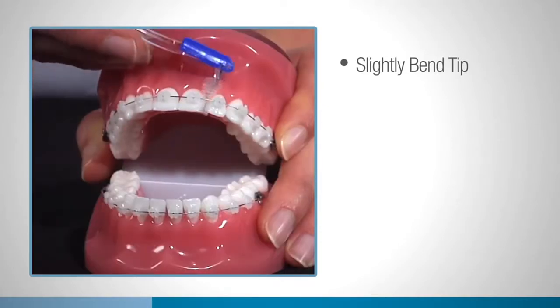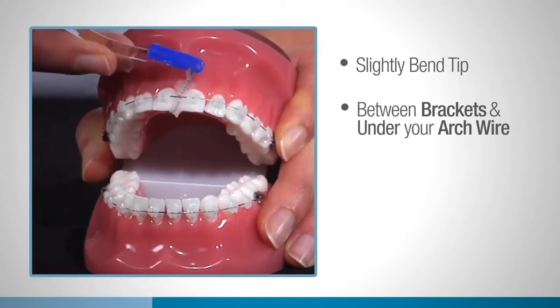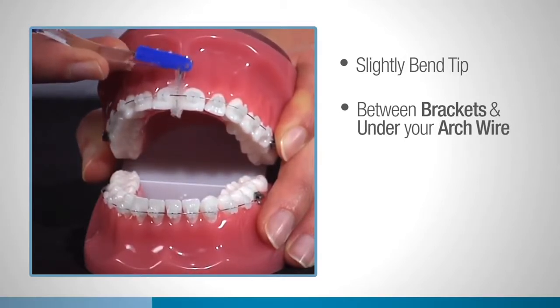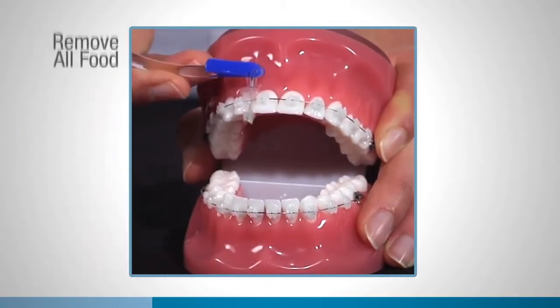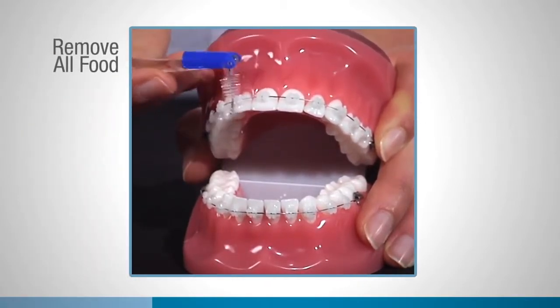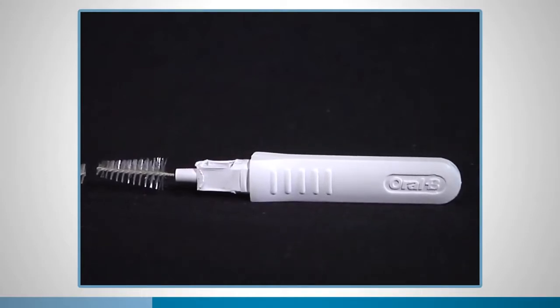Slip the interproximal brush in between the brackets and under your arch wire, away from the gums, to gently remove food debris. The interproximal brush is a great way to check to make sure that all the food is gone, and it only takes about 30 seconds to do. Since some are pocket-sized, I suggest you keep one with you just in case you need it after meals and snacks.